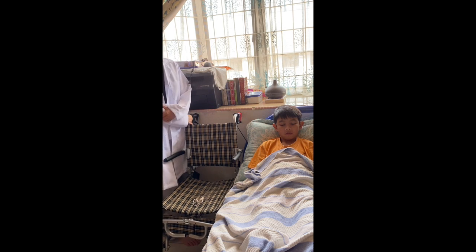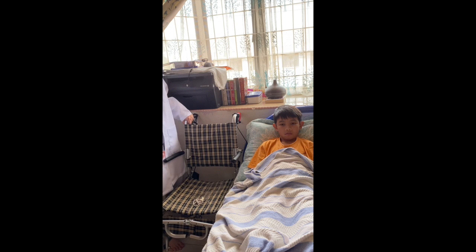Hello, my name is Hidayah and today I will be showing you how to move the patient from the bed to the wheelchair.